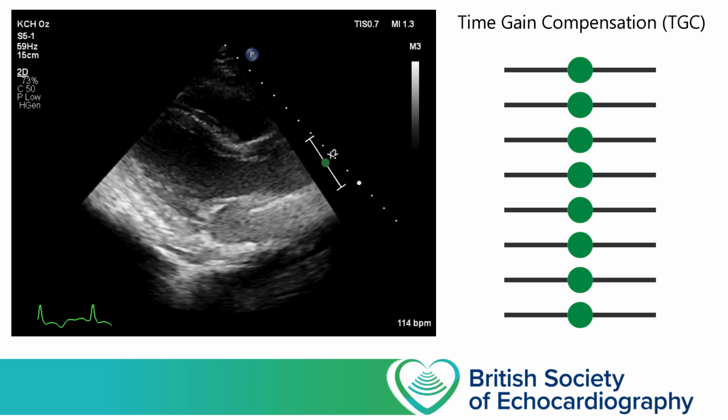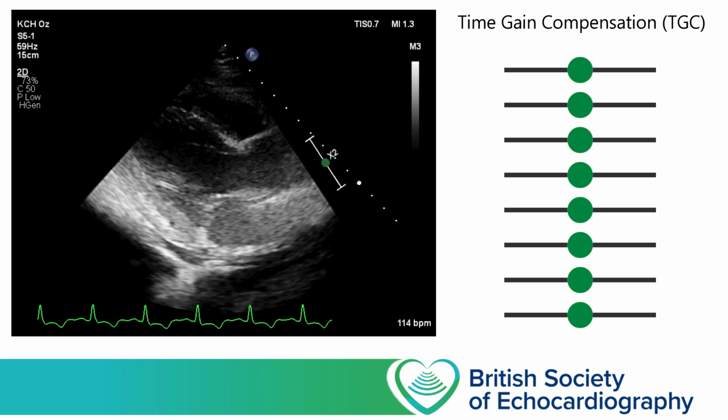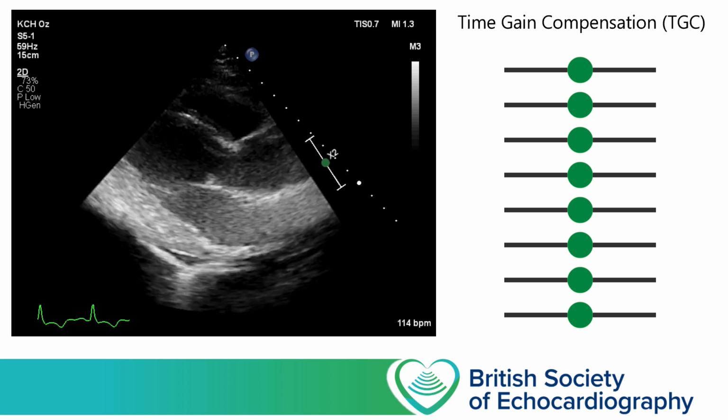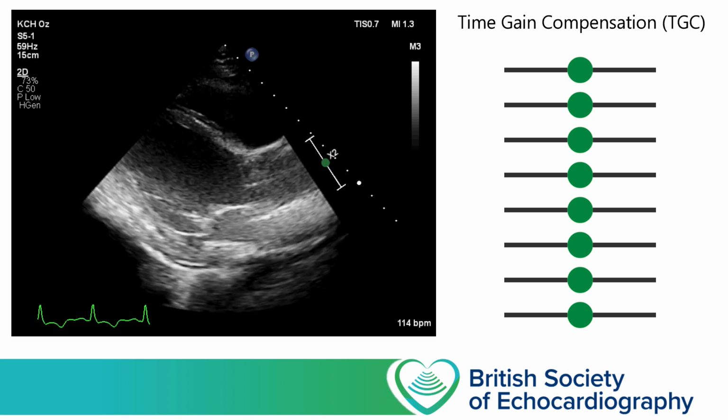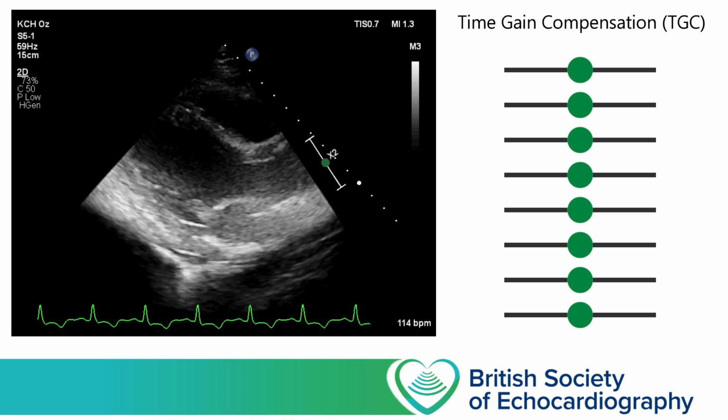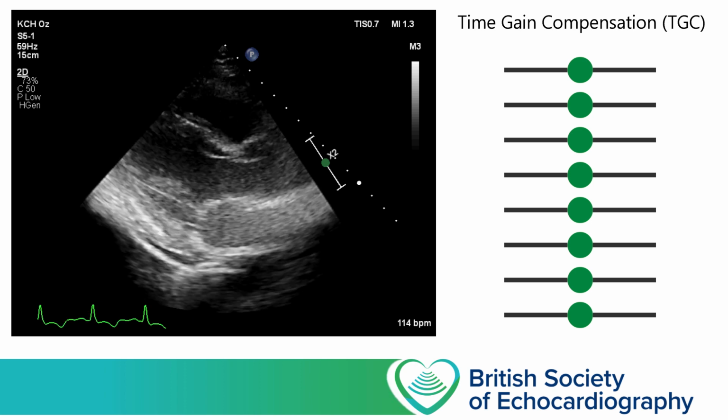Now sometimes when we see the image displayed on our screen, we're not entirely happy with how the ultrasound software has tried to produce a balanced image. We might have areas within that image that appear too bright and other areas which appear too dark. Let's take this image as an example. Here the near field is darker than we would like it to be, and there's a band of excessive brightness about 3/4 of the way down the image.